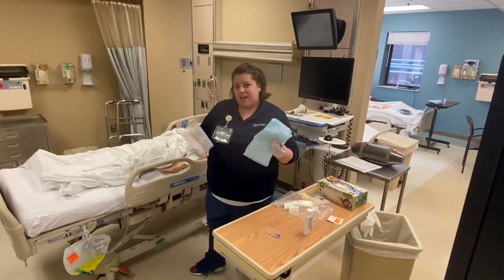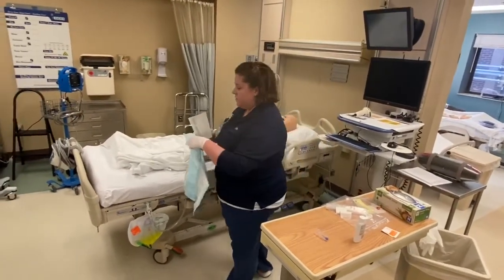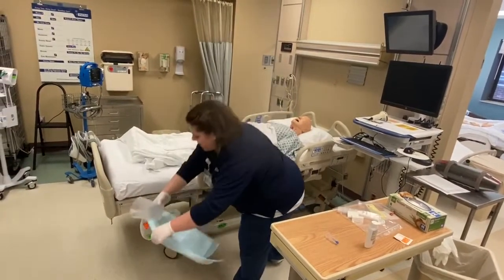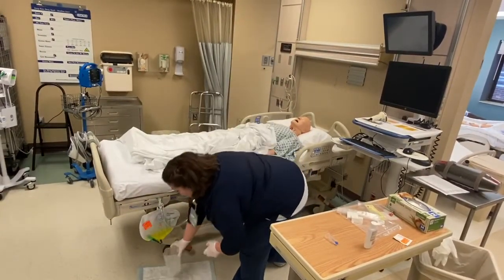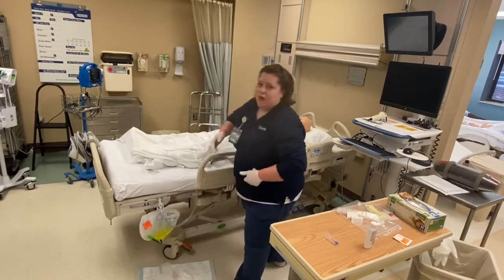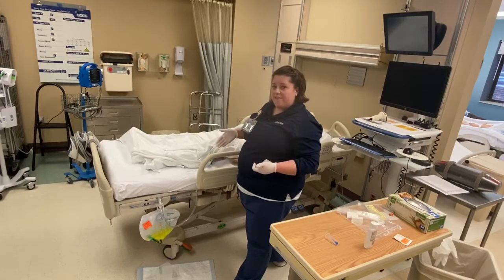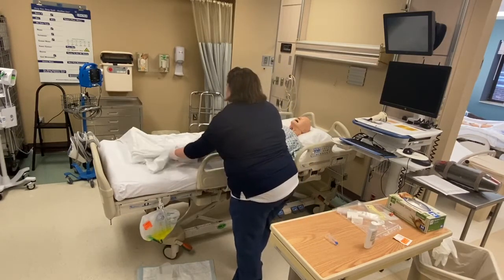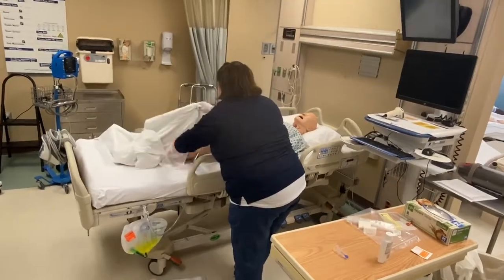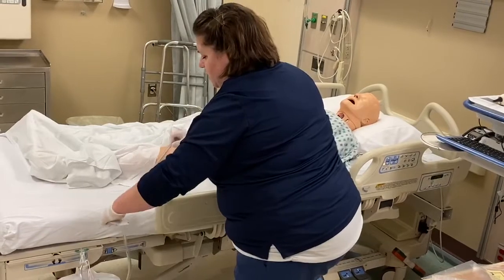I want to make sure that I don't get any urine on the floor, so I'm going to set the pad down on the ground underneath of the Foley bag, and I'm going to put my canister down there as well. Now, we talked about dependent loops earlier, so I want to make sure that I don't have any dependent loops in my patient's Foley catheter. So I'm just going to adjust the catheter, and I'm going to move this clip down here.